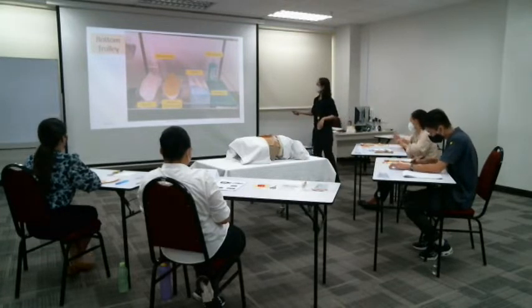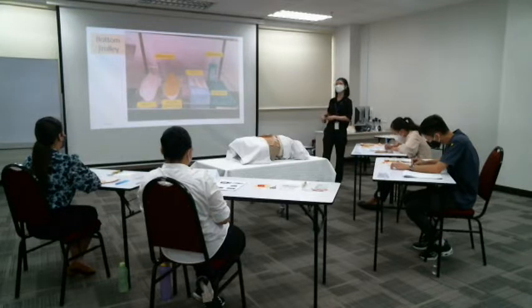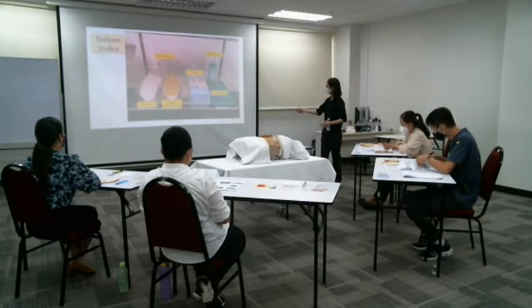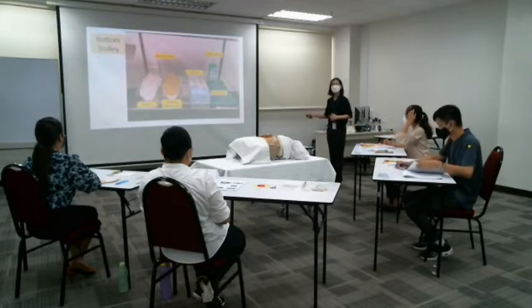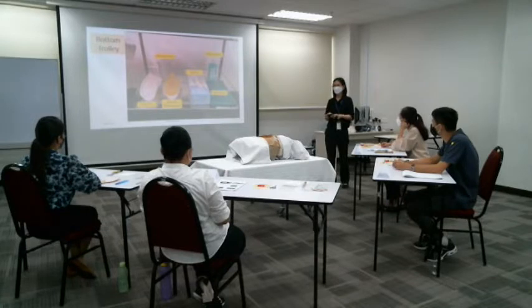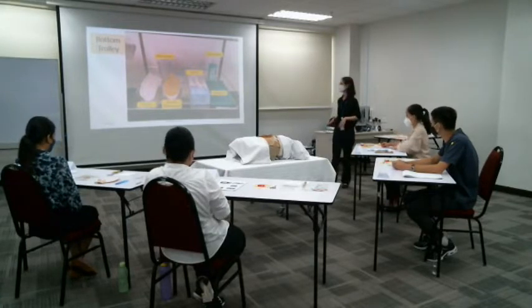Then you need a disposable glove. Yes. If self-managing, ostomates don't use gloves, it's their own body discharge. But if you are doing for somebody, caring for somebody, you need to wear gloves. Okay, this is touching the patient's body. Then you have a Macintosh or Inco pad. This is the protective lining to prevent soiling of the bed sheet or the floor.